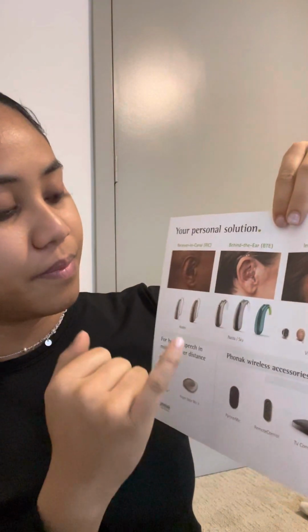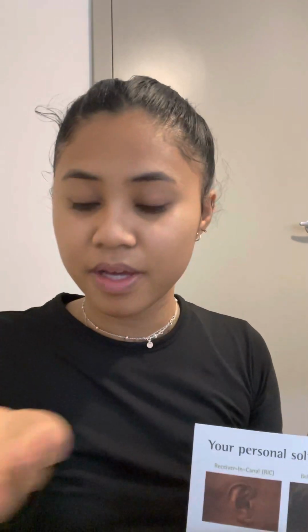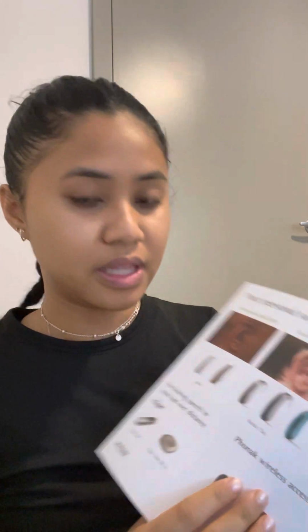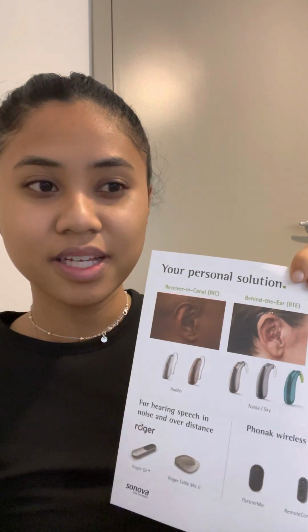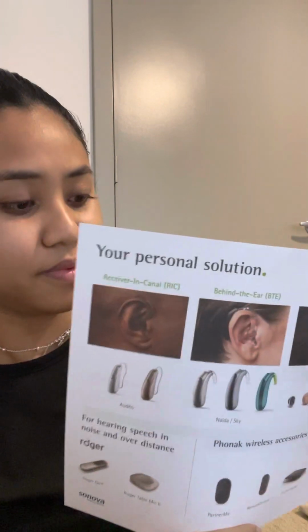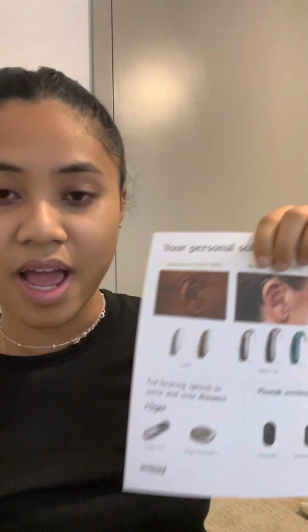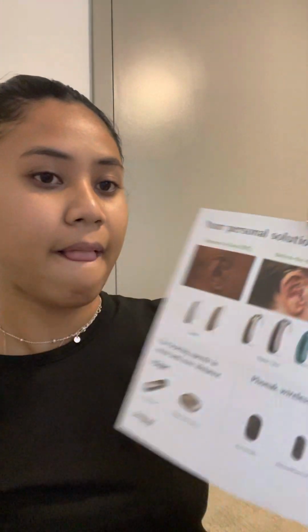But apart from the physical properties of it, the fit will be secure enough so that it won't move anywhere, and it'll really help. You'll be able to handle it well with your hands. The sound properties of it: this one, I think, will really capture all the sounds that are less heard, so that all sounds and all speech to you is crystal clear.